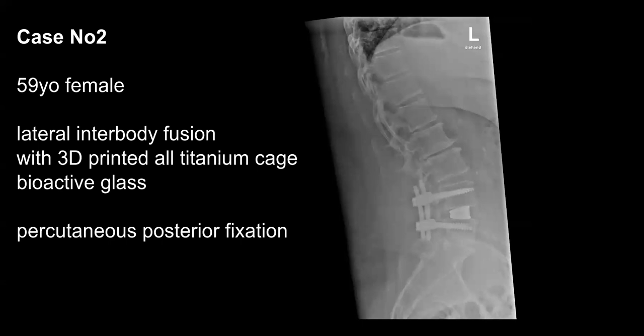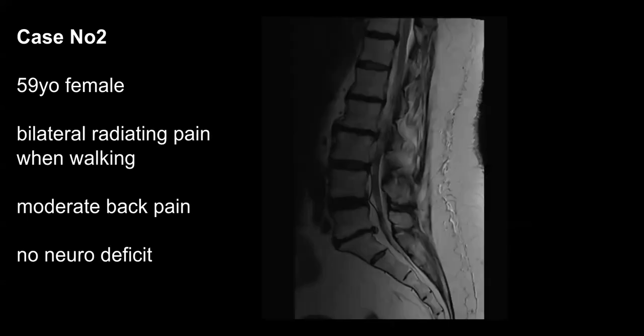Yeah, it is. I didn't mention this, but in this patient as well, L5-S1 is not unsuspicious. You see, it's a very narrow disc, and there's some, not a real hernia, but an extrusion of the disc. The foramina are not so wide.